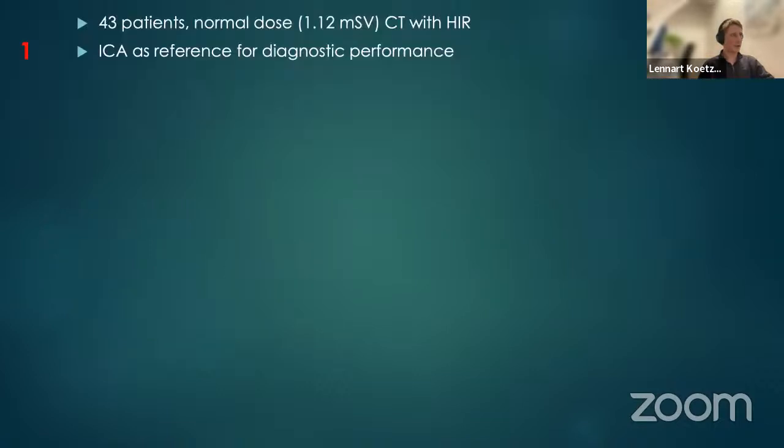So in the first study, 43 patients were scanned on a normal dose. And this scan protocol was designed for hybrid iterative reconstruction. So this is a normal dose for performing a CCTA.